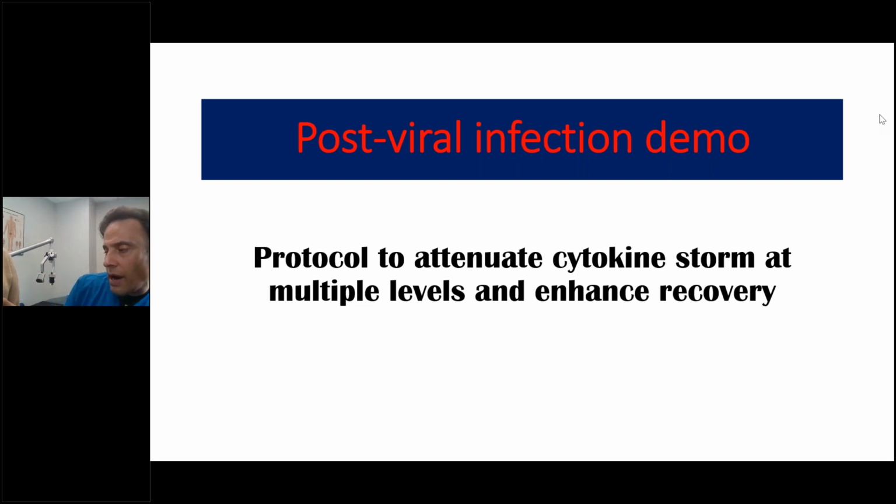So I am now going to go here. I'm going to go back. I'm going to be mode select. Hopefully everybody can see. And if you can't see, Kate, feel free to interrupt me. I'm going to go to the acne setting. I'm going to turn the violet light on because I want to stimulate the vagus nerve. The vagus nerve is cranial nerve number 10.